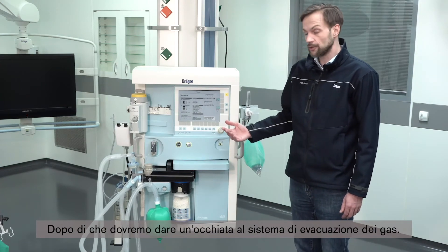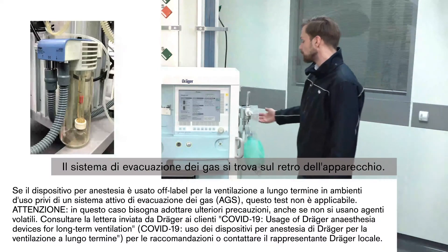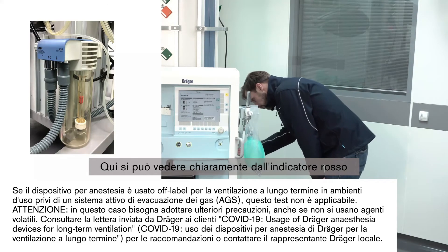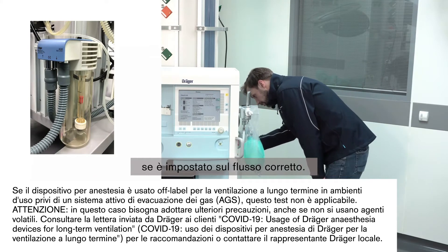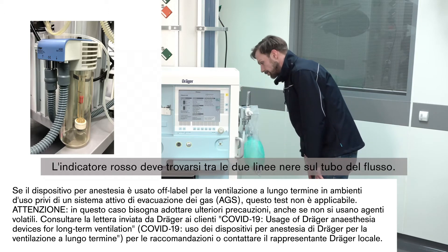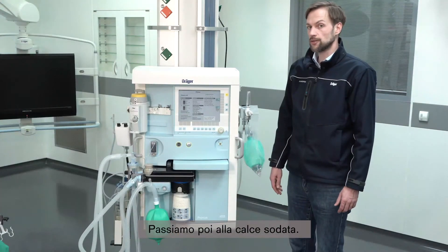After that we should have a look at the gas scavenging system, which can be found on the back of the device. You can clearly see by the red indicator if it's correctly set to the correct flow rate. The red indicator should be between the two black lines on the flow tube.